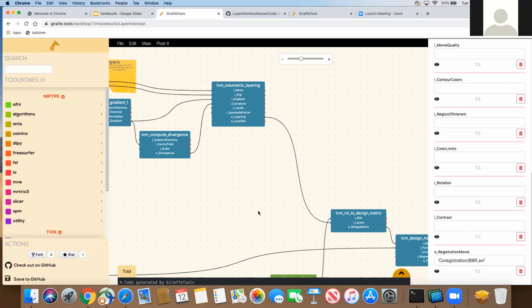One of the things that John mentioned in his talk was that people have been using different, I can draw here, right? One of the things people have done classically is find different cortical layers, at least something approximating layers, and interpolating the volumes at those points. One of the things we've been experimenting with is doing that slightly differently, not by interpolating, but by means of a spatial regression.